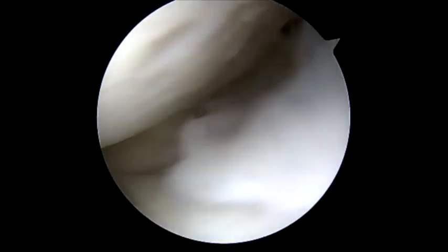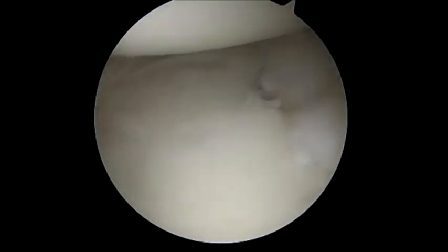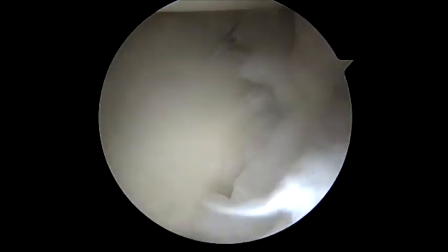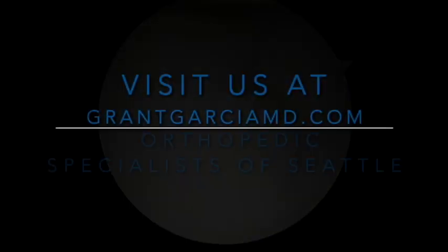In this situation it was a reverse HAGL. There was also some posterior labral cracking, as she had posterior instability on exam, so we elevated the posterior labrum and performed a knotless low-profile posterior labral repair. You want to be careful not to over-tension the capsule — you've already tensioned it quite well with the reverse HAGL repair. There was no further instability on examination and the anterior labrum was untouched.